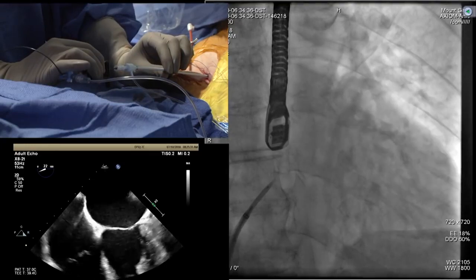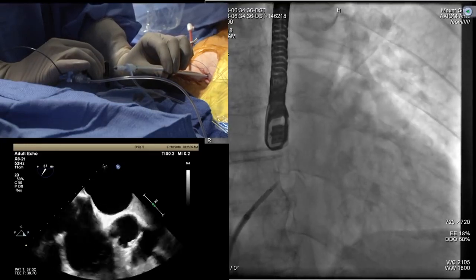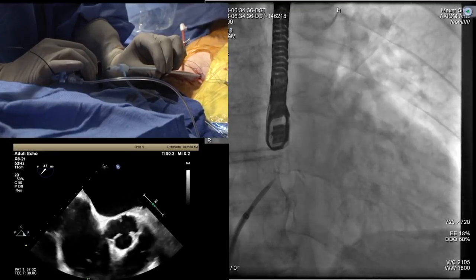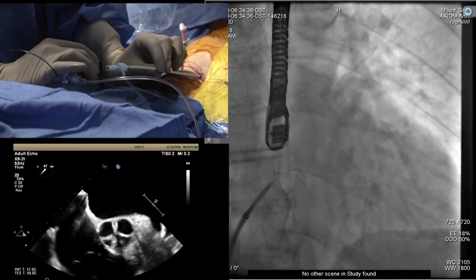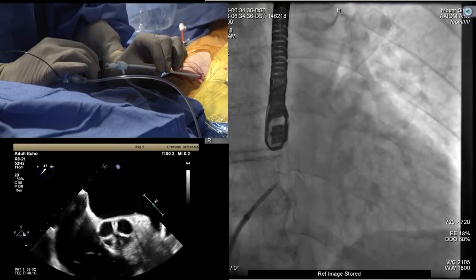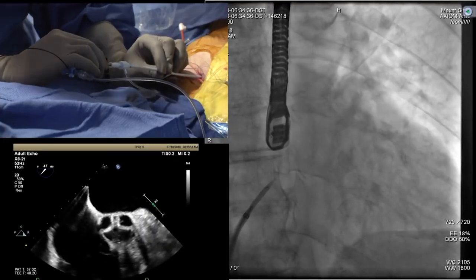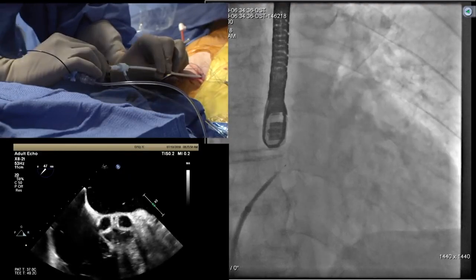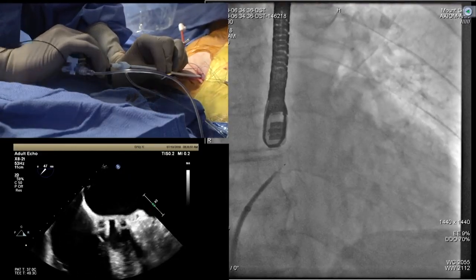More important is the height, and the other thing is posterior. Good. Everybody agrees? I think it's a beautiful demonstration of how important this is. And with 4.1, especially with this new XTR, it's perfect. The longer arm will allow you to have a beautiful result. You need to see the little bubbles. Nice. Okay, so we're going in.